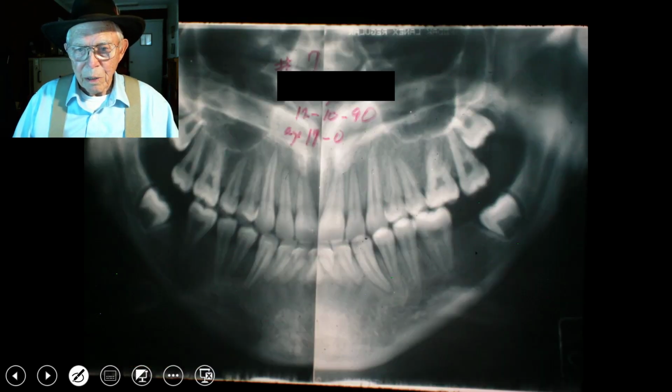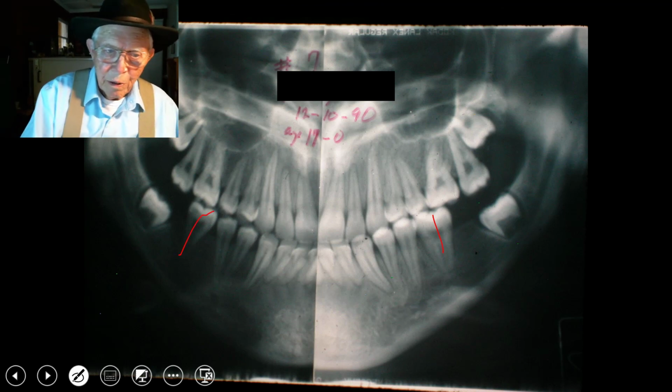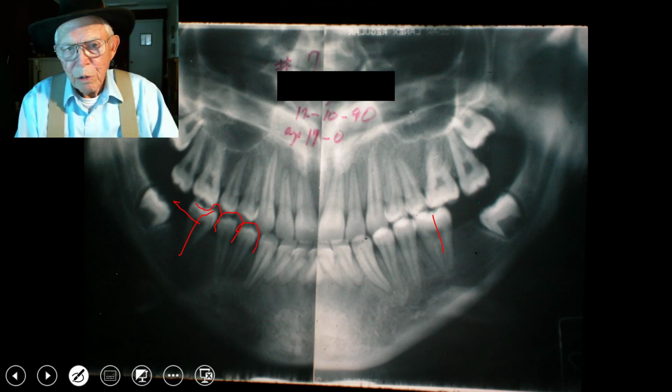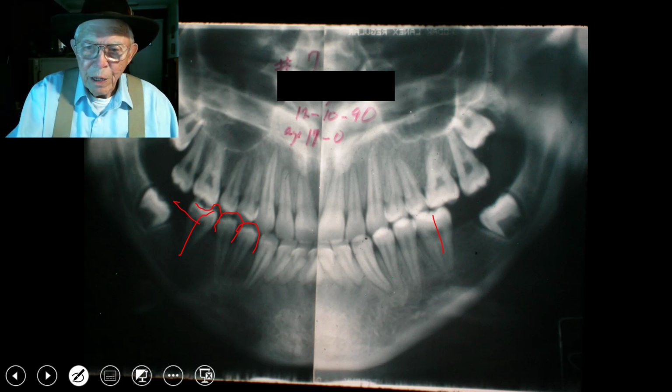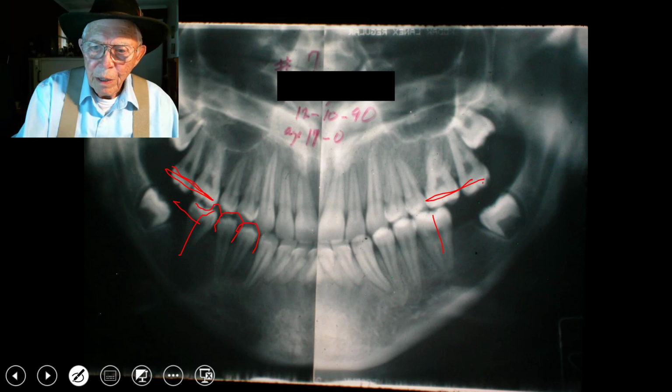Okay, and now the second molar is this tooth right here. That's not the 6-year molar. The 6-year molar is moved up, and now we've got this molar in a class 1 relation. The bicuspid's coming up in here. This first bi's in here, and these teeth are back underneath here with overjet and overbite and everything working fine. And we'll have to have retention that keeps this tooth up in the air here and keep it from closing on that. And as this tooth comes forward, it'll move out in that direction.